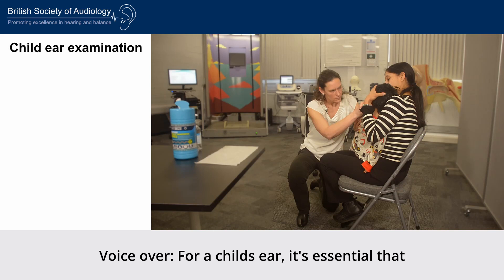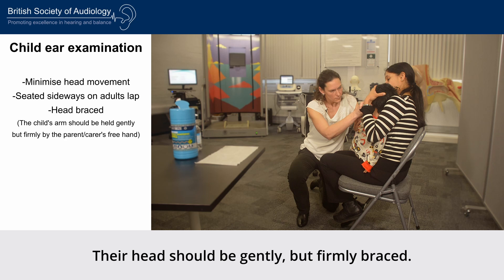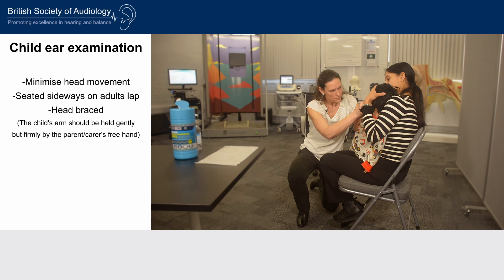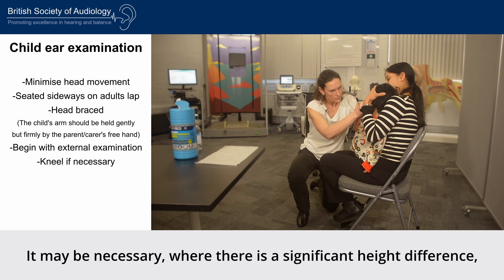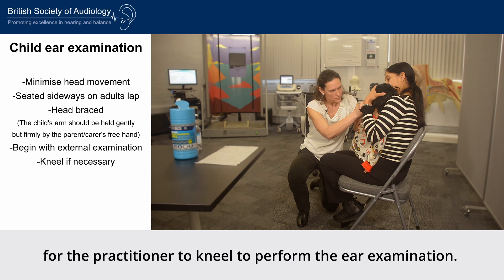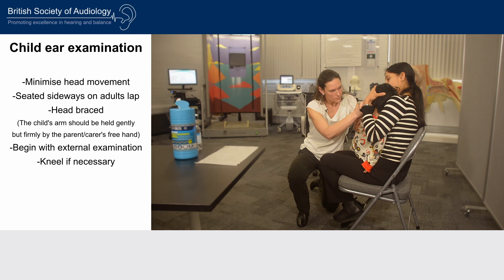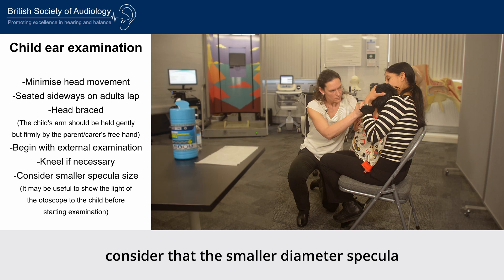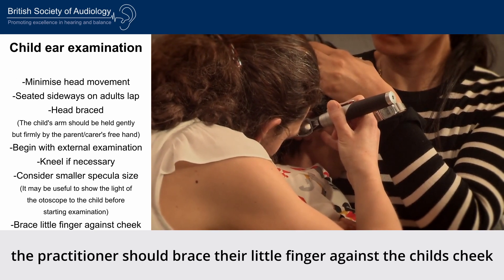For a child's ear, it is essential that head movement is minimised. Children who may be unable to sit still independently during the procedure should be held sideways on an adult's lap, with their head gently but firmly braced. The practitioner should begin with an external examination using the otoscope light. Where there is a significant height difference, it may be necessary for the practitioner to kneel on one knee for maximum stability. Note that a smaller diameter speculum may be required. The practitioner should brace their little finger against the child's cheek in case of any sudden movement.